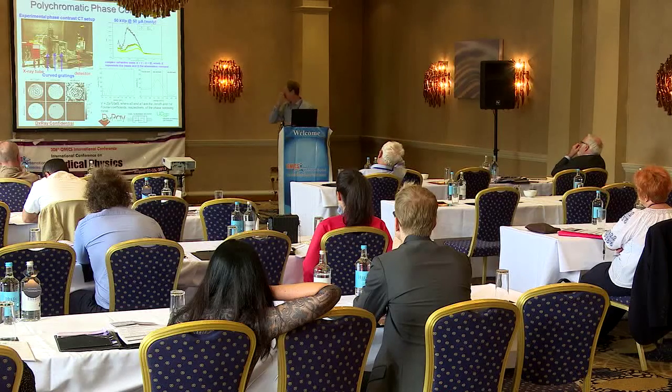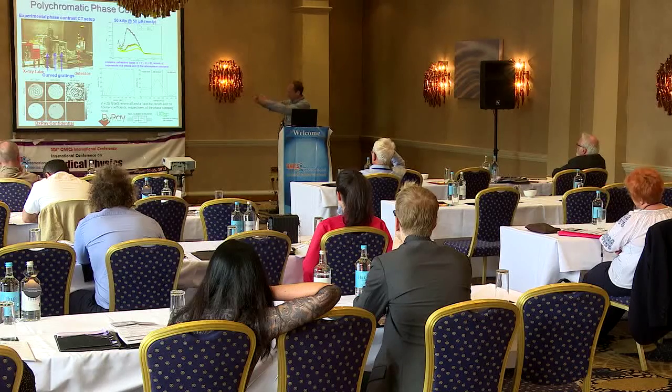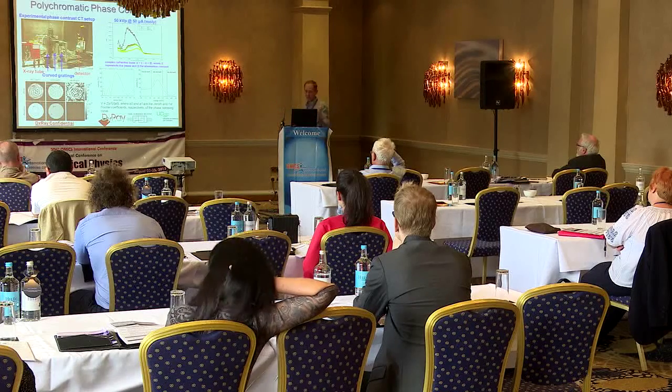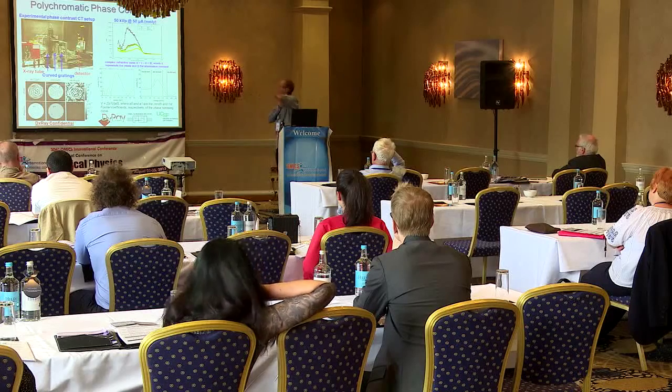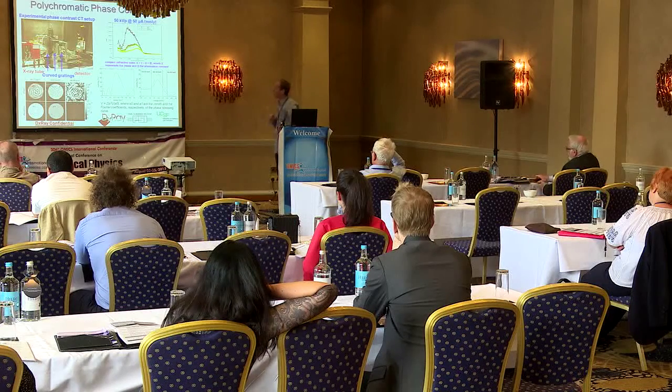And so at the PSI Institute in Switzerland, we made some curved diffraction gratings to open up the field of view into a fan beam, and then use the energy resolution of the detector to account for that energy change out of in line, to be able to produce phase contrast images.